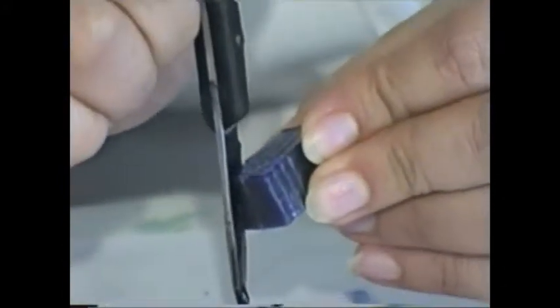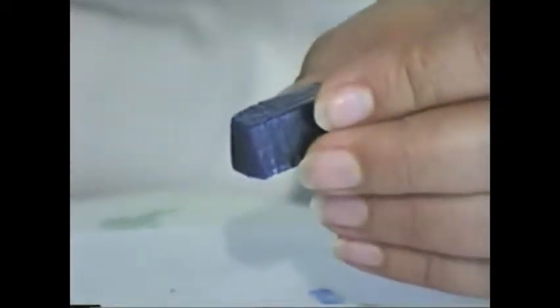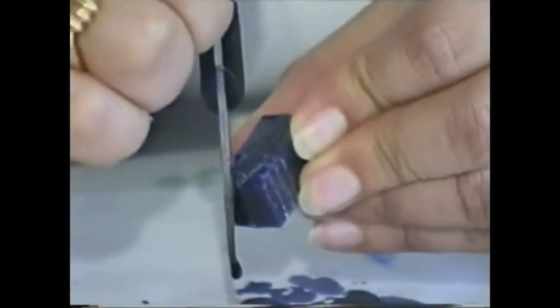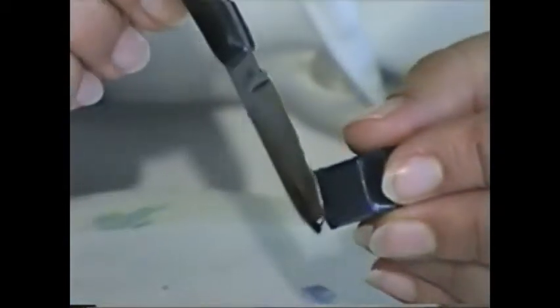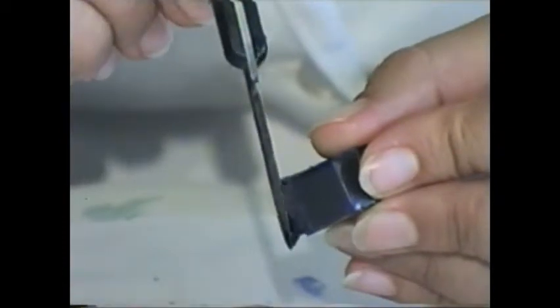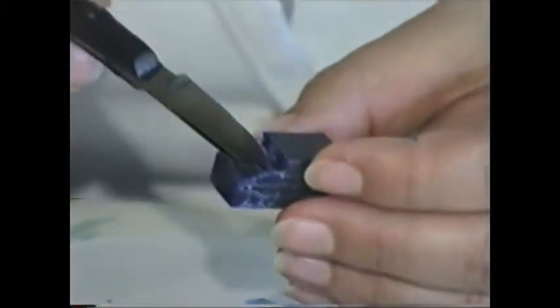Then make the labial outline slightly convex or straight, slightly convex at the cervical third, then straight in the middle and the incisal thirds. Leave about 1 millimeter all around the borders. Smooth the surface. The surface should be smooth.